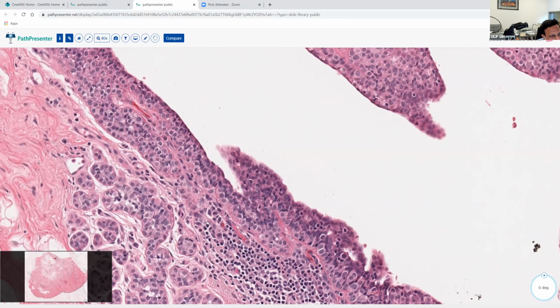So that was that. So in those cases, when they do excision, you will have more material, and then hopefully the picture will become clear. Now, the reason why I'm emphasizing this is that if you just call it like that on core biopsy as LCIS, depending on what the imaging findings are, sometimes if the imaging is not really that impressive, a radiologist might interpret that as, okay, this is some kind of incidental LCIS for which no action may be needed.